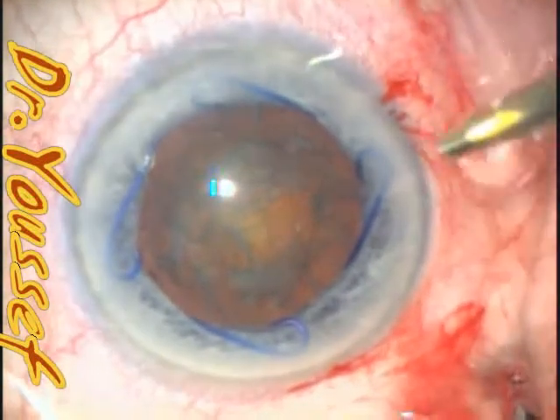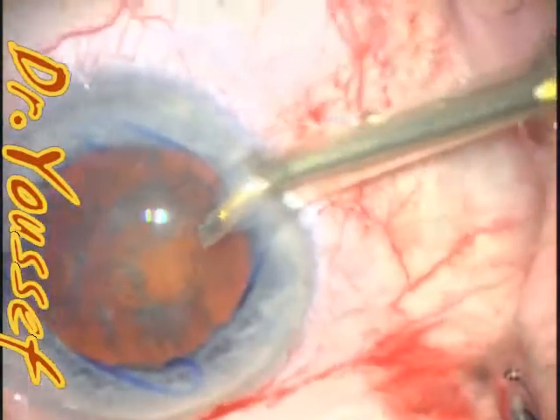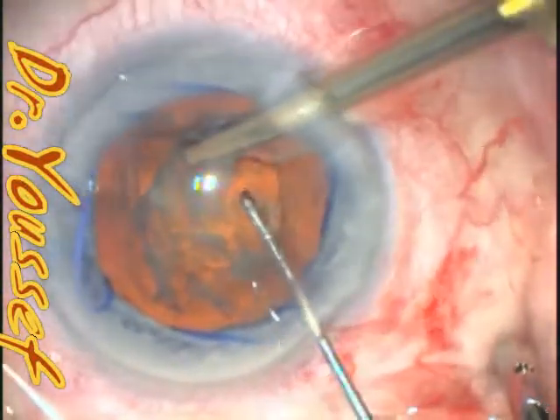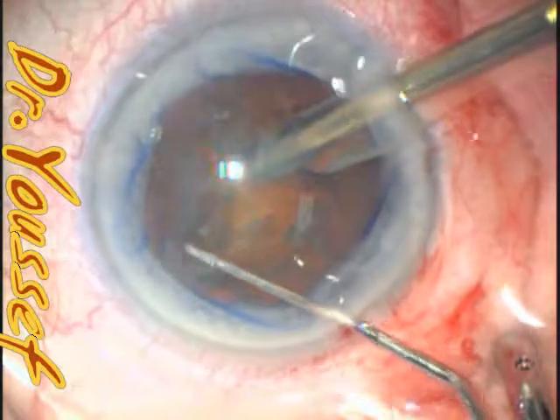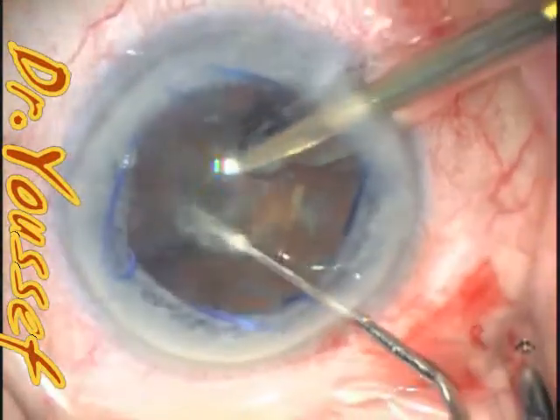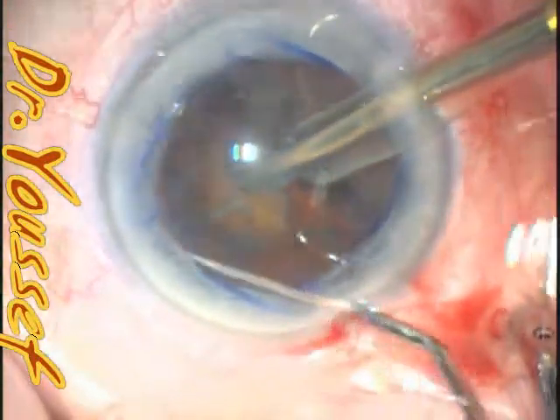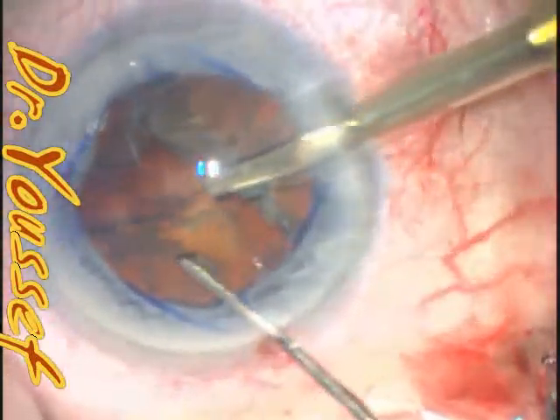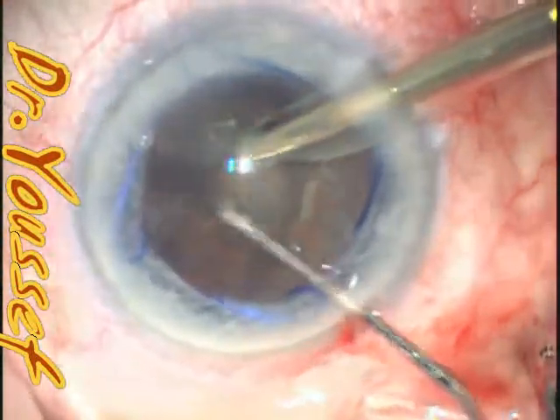The phaco started as usual. This is the FX handpiece again on the Signature machine. I use the chopping all the time, and this is horizontal chopping. This is like a grade 3 cataract, so let's remove it the same way.